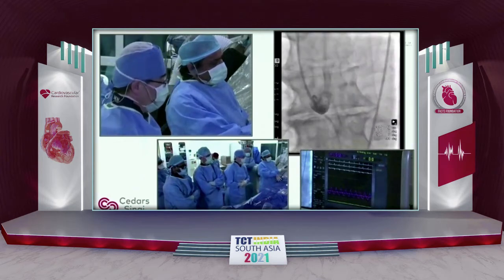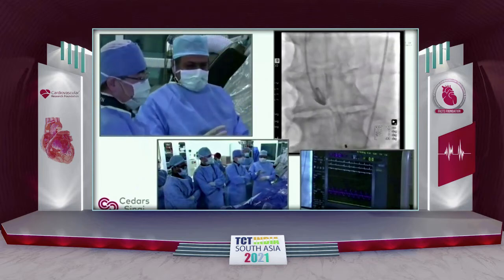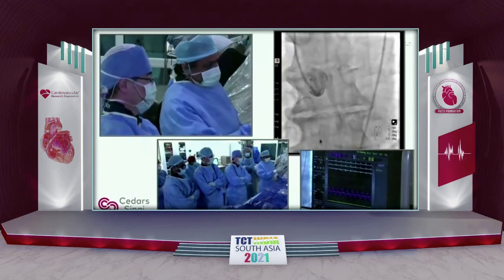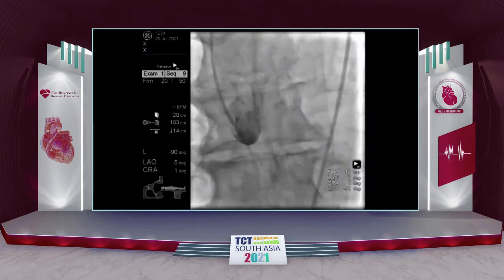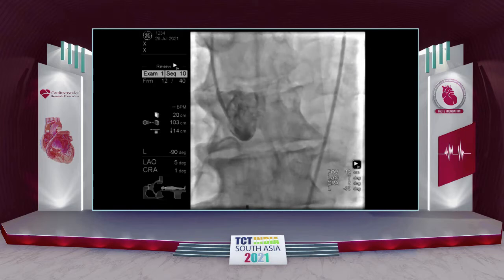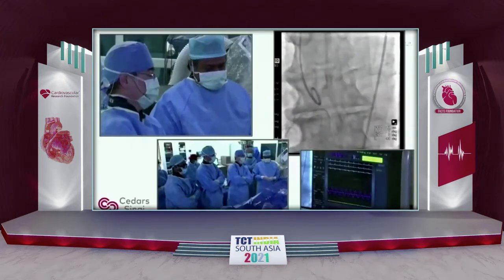And now this is where you can actually appreciate the calcium in the aortic valve. I somehow thought that we missed showing you the CT image of where we actually saw a lot of LVOT calcium on CT. You can see that a little bit here, right below the left cusp. This is not a very complex case, but we thought we would still try to make some teaching points. But it is a very tight aortic stenosis.